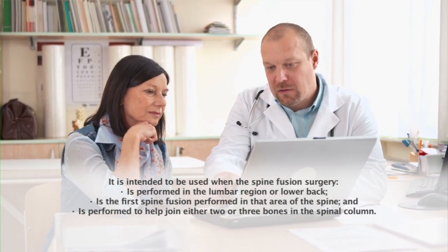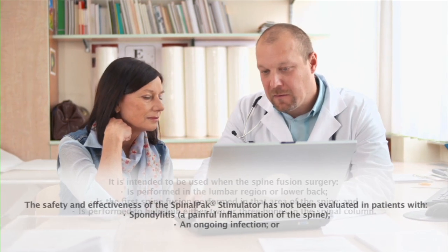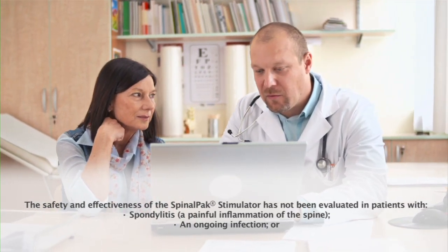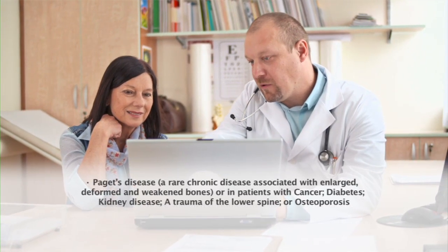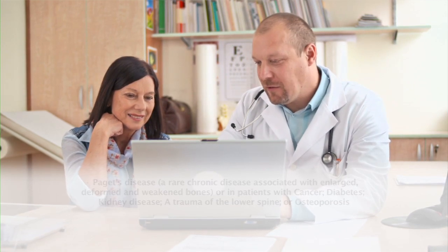In addition to the risks common to all of Biomet's bone stimulation devices, the OrthoPAC Non-Invasive Bone Growth Stimulator System should not be used to treat certain types of non-healing fractures that are malaligned or have fluid-filled gaps. The EBI Bone Healing System should not be used to treat certain types of non-healing fractures with fluid-filled gaps. Talk to your doctor for more information about these risks or visit our website at LearnAboutBoneHealing.com.